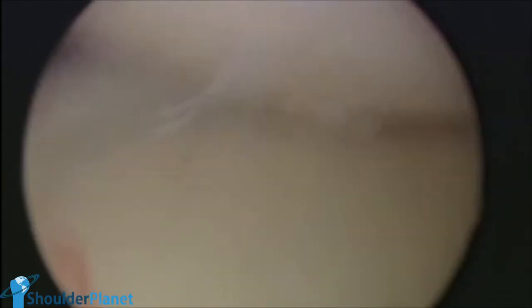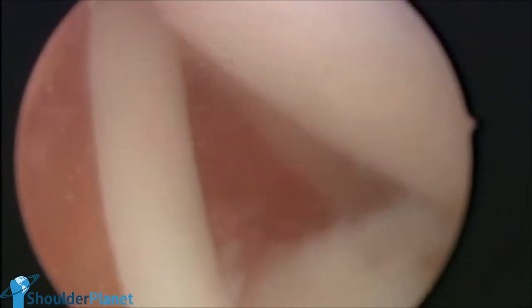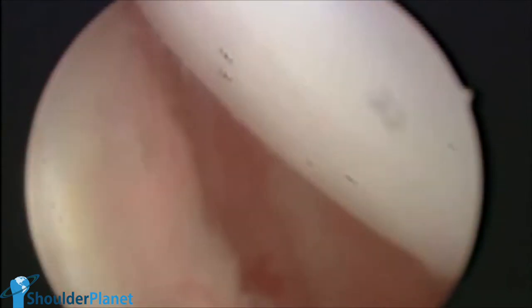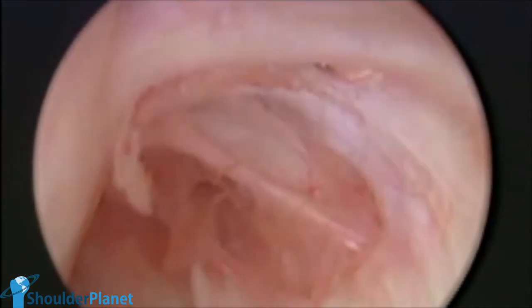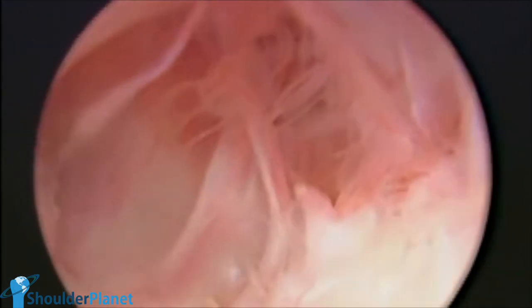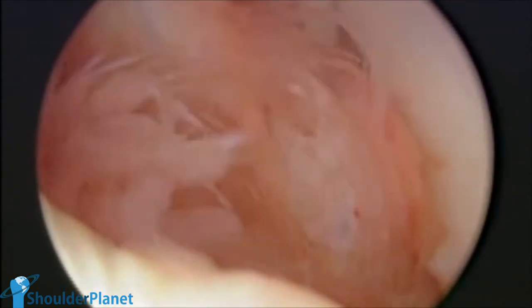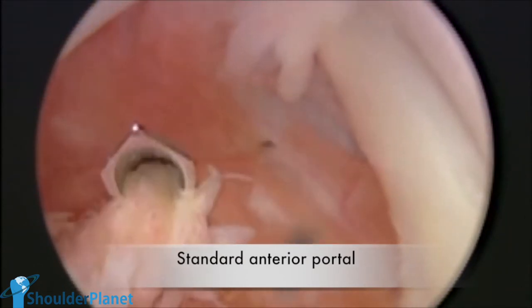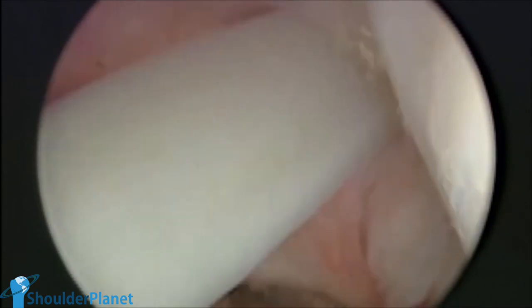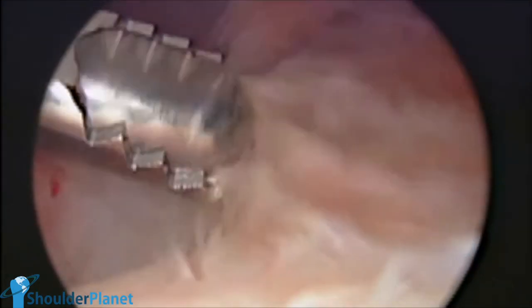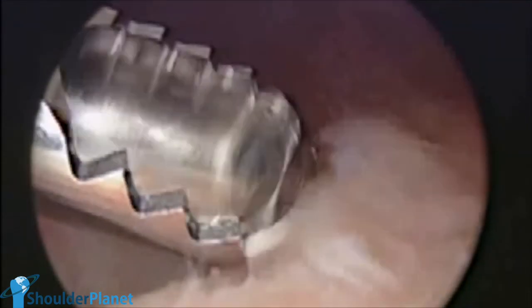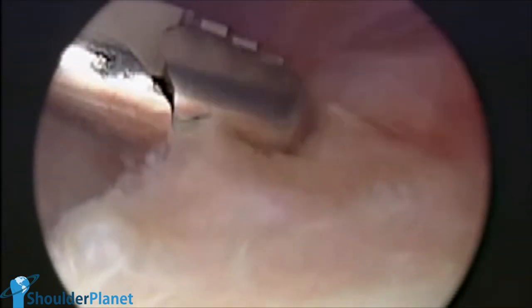This is a right shoulder. We have seen the Hill-Sachs lesion, which was really not very big in this case, and the long head of the biceps that was pretty okay. Now we've seen the upper border of the subscapularis, and now this is the posterior part of the axillary recess in which we can see the posterior inferior glenohumeral ligament that was quite inflamed. And here is the place in which we would find the HAGL lesion. The first thing to do was to establish a very standard anterior portal.